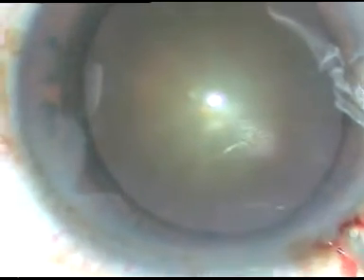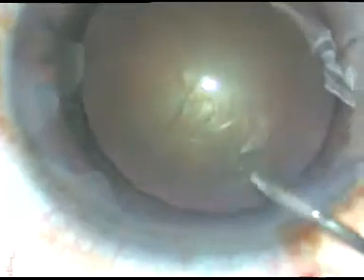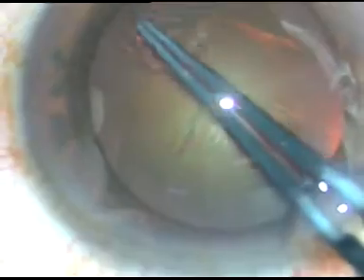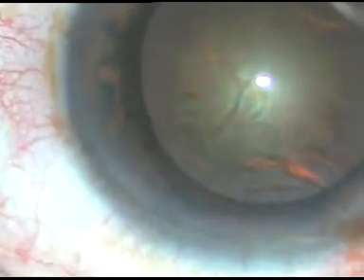Now, capsulorrhexis is to be done. I am introducing the cystitome 26-gauge bent needle through the main incision and raising the capsular flap like this. Now I will use the Utrata forceps. I will hold this capsular tag with Utrata forceps, go anti-clockwise and do a CCC — continuous curvilinear capsulorrhexis. The rhexis tended to go to the periphery at around 2 o'clock, but I could retrieve it easily.